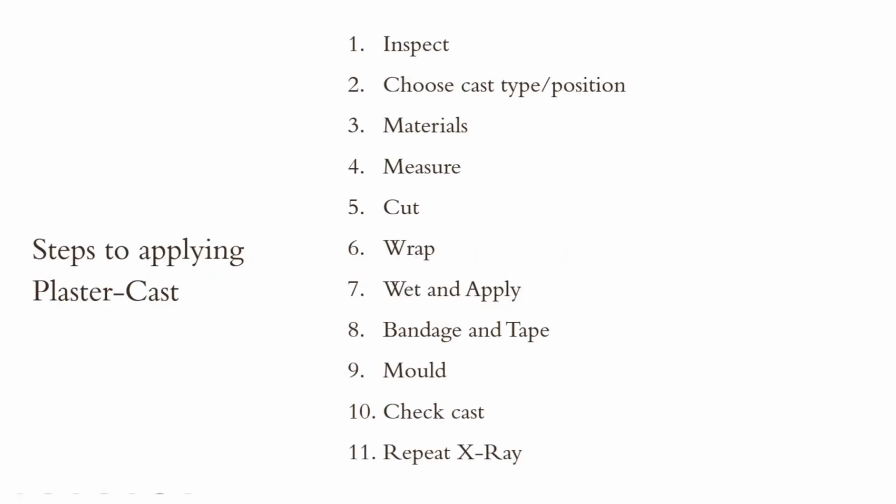We will now go through the key steps involved in application of plaster casts, right from the inspection of the limb and choice of casting, through to the material involved, the steps of applying the cast, as well as moulding of the cast.